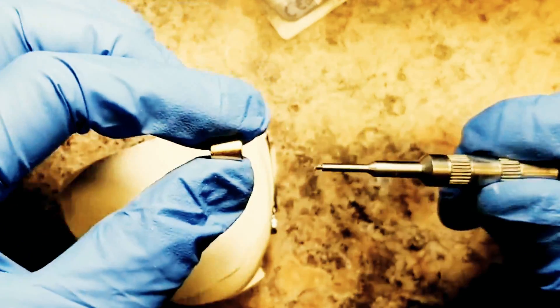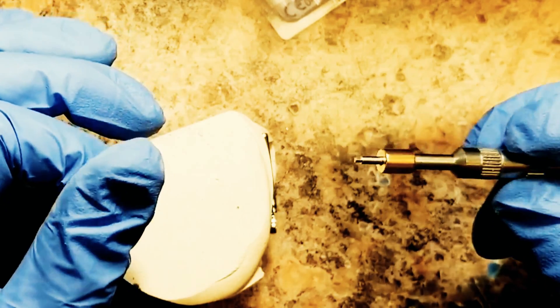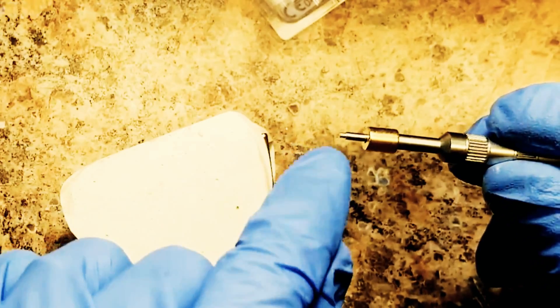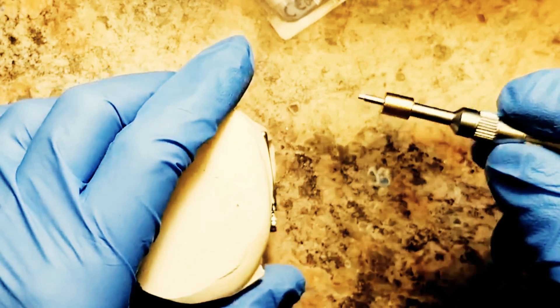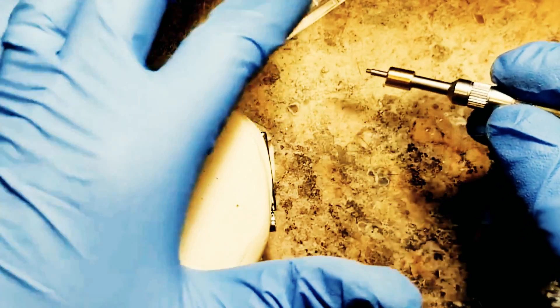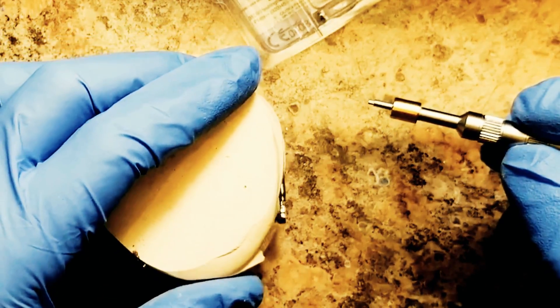I highly recommend using this. It's definitely an aid to help you have fewer problems fidgeting with putting on your Hanks telescoping arms, or your Aplicore screws, or your standard hex head screws for your standard Herbst or Miniscope arms.